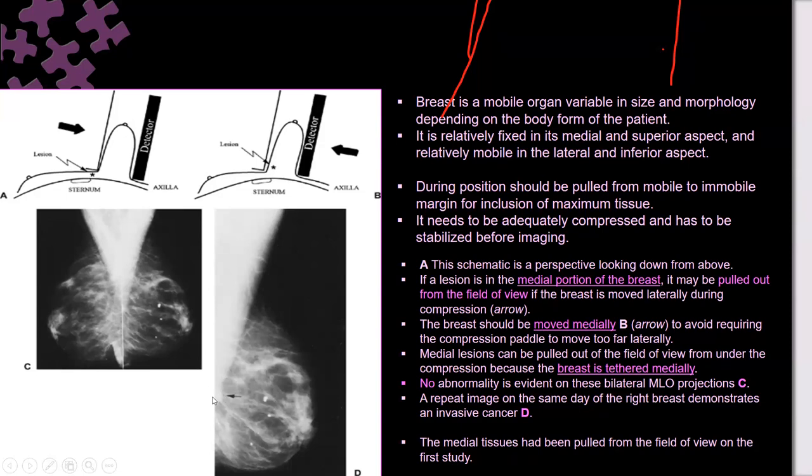Do you remember when we said we will go directly to the extended lateral view? Because the lesion is usually posterior, superior posterior toward the axillary tail, but the medial one is usually toward the apex of the pectoralis.